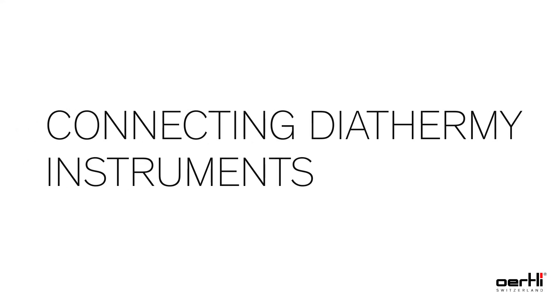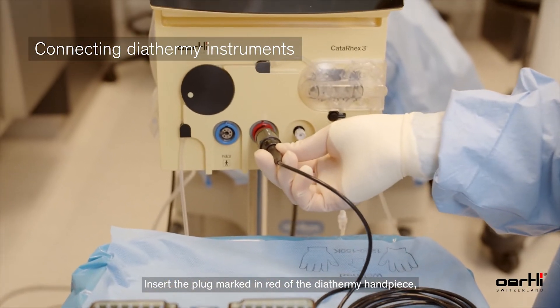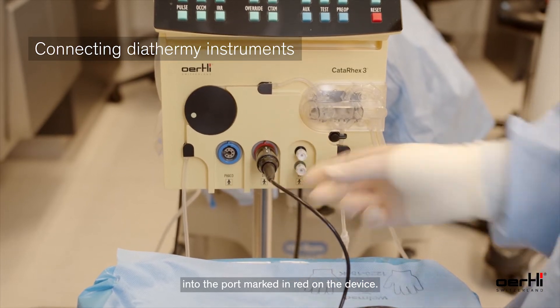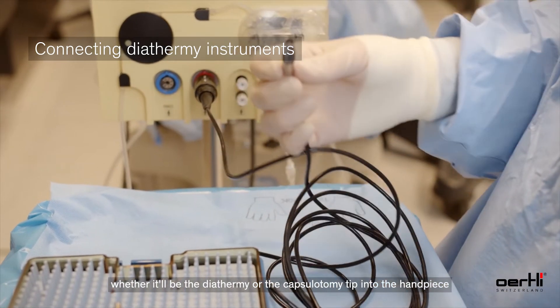Connecting Diathermy Instruments. Insert the plug marked in red of the diathermy handpiece into the port marked in red on the device. Insert the tip — whether it be the diathermy or the capsulotomy tip — into the handpiece.